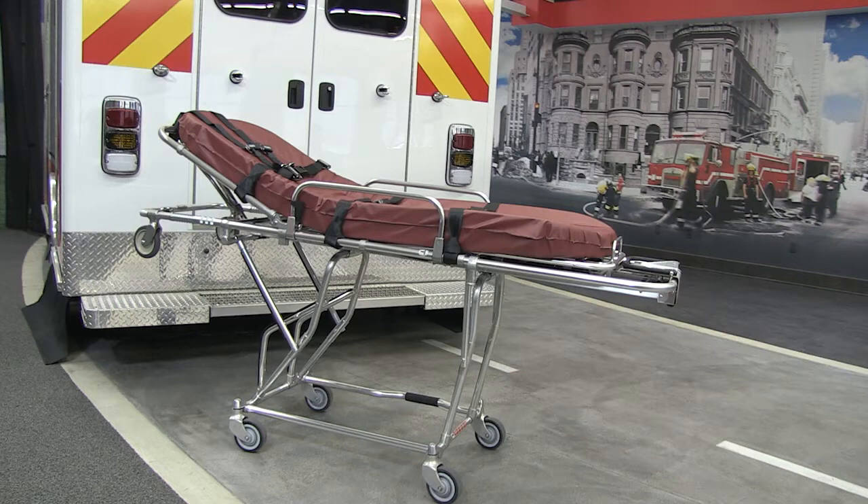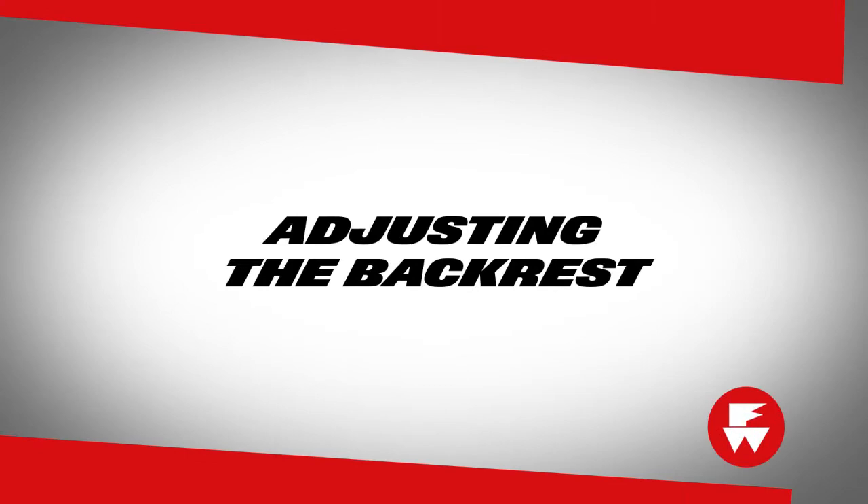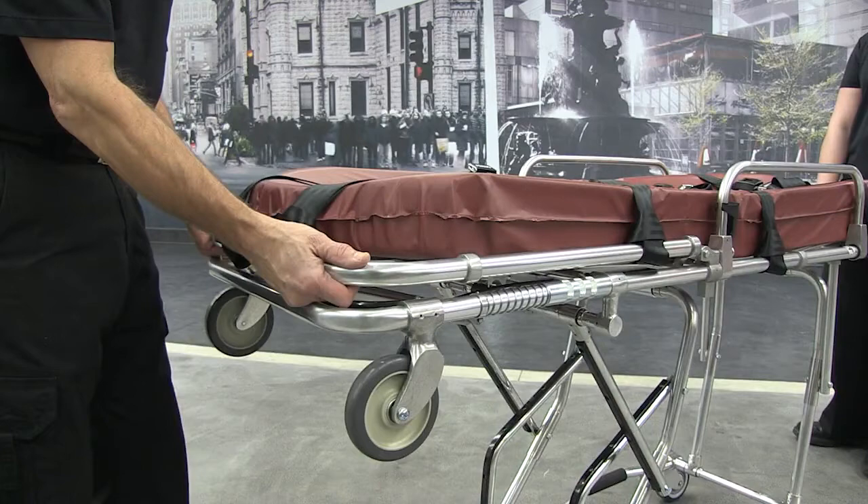We will now review operations of the 93ES Squad Mate ambulance cot. The backrest can be adjusted to eight positions.